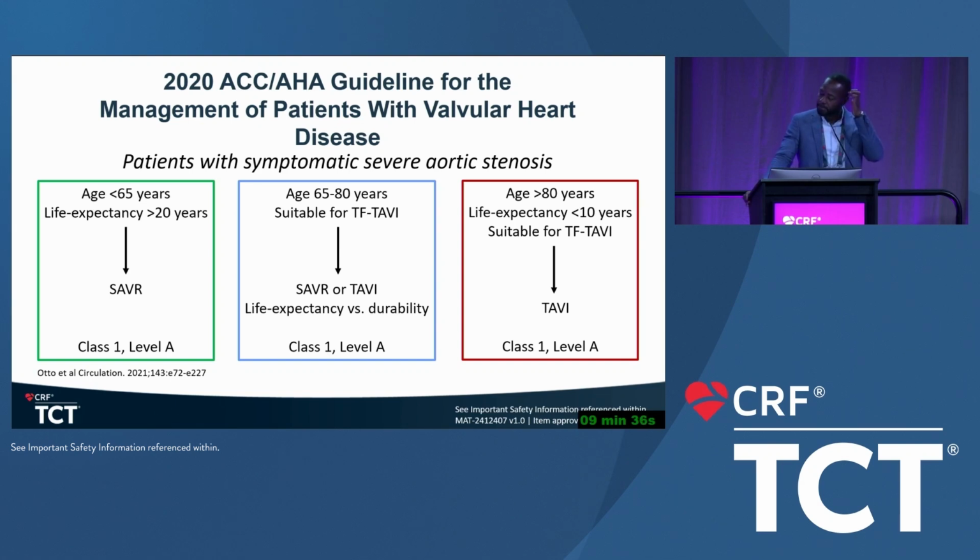Exactly. That's a great question. Commissural alignment is important for certain platforms. It is maybe less important with this platform. If you align your flush port to 12 o'clock, you're already 50% aligned. So that's half the patients.